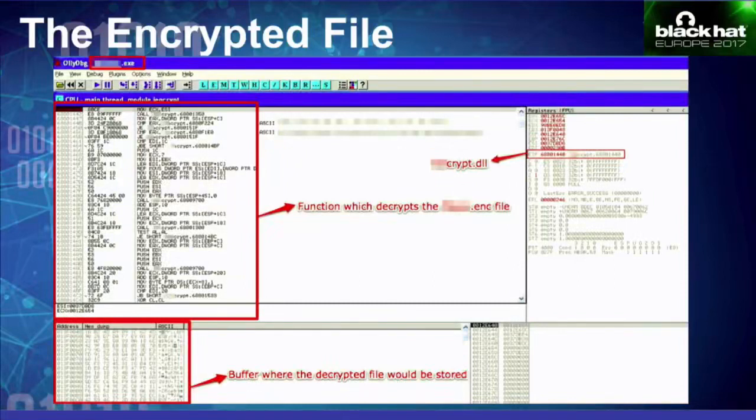And again, after spending several hours on it, we finally located a function. This block of code, which is highlighted in red, is basically the code that decrypts that file. So what the application does is it looks at the file, and if it finds the file, it loads the file in memory and then uses this logic to decrypt the whole file. Again, it took a few more hours to reverse engineer the whole logic of decrypting the file. Essentially, I wrote a Python script that would locate the file and then decrypt it so that we can view the contents of the file.